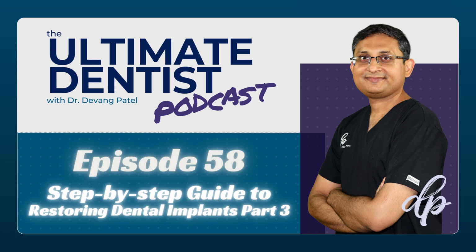Now if you have taken a periapical radiograph at any point, at implant placement or healing abutment or impression post, whatever the latest, let's say if taken for implant placement and impression post, I would send the technician the X-ray with the impression post in it. The reason is, once you take the impression, the technician will know where the soft tissue contour is, but they will not know where the bone underneath that soft tissue is. So with the X-ray, they will be able to assess where the bone is.